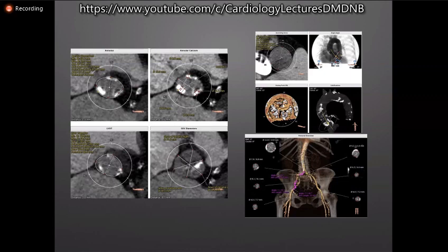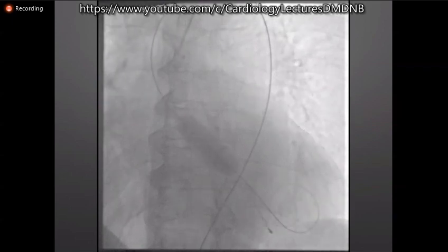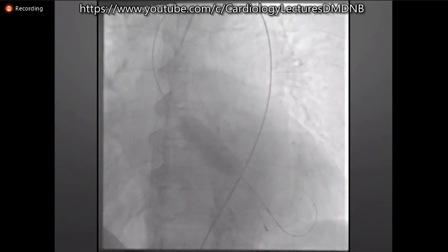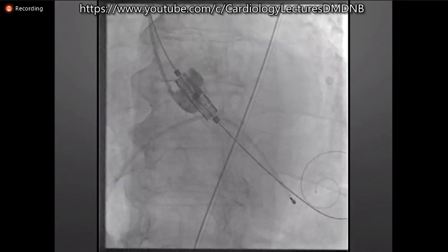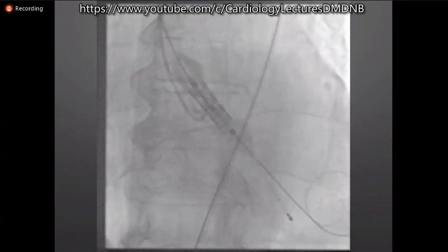And I thought it would be better for this lady to do a self-expandable valve implantation, but the team was keen to proceed with a balloon expandable, so we chose MyVal 26. Because of these calcifications in the aortic annulus, we decided to do predilation with the smallest balloon that we have. So we did the predilation with an 18 millimeter balloon. After predilation, we checked the position of the valve, and there were no issues regarding implantation.